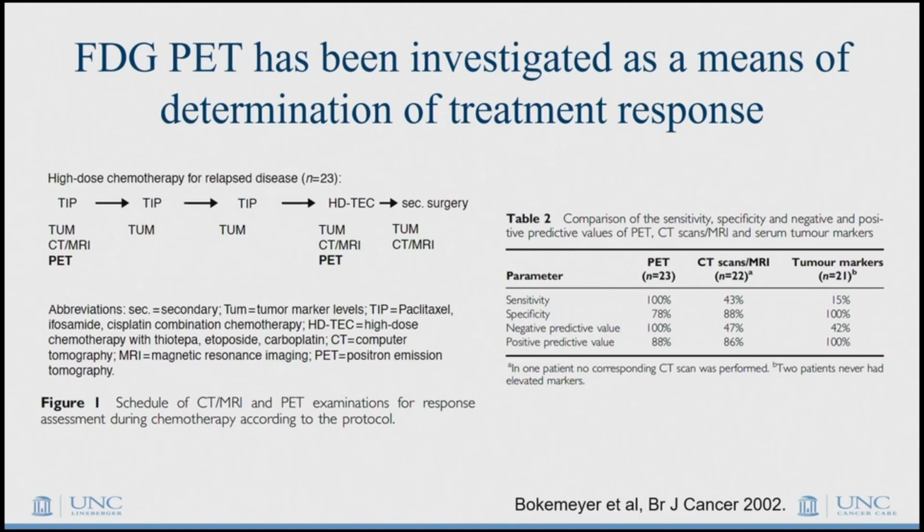The evolving world, and this is really still investigational, is looking at PET for germ cell tumors in determination of treatment response. And so this was essentially an early study that showed that you can use PET, much like we use tumor markers and avidity on PET to look for response. And so, they did a PET before chemo, they treated with several cycles of chemotherapy and did a PET afterwards. And you can see that if you look at sort of PET changes, it improves on conventional imaging in whether or not there's residual viable tumor, not too dissimilar to how we use tumor markers.